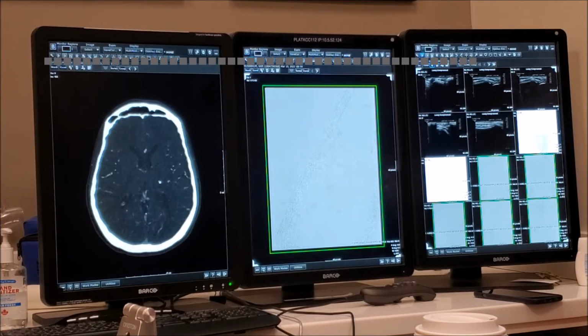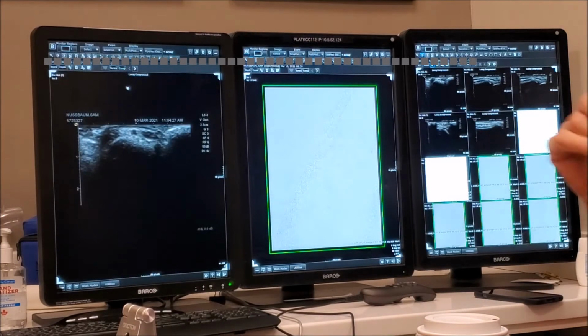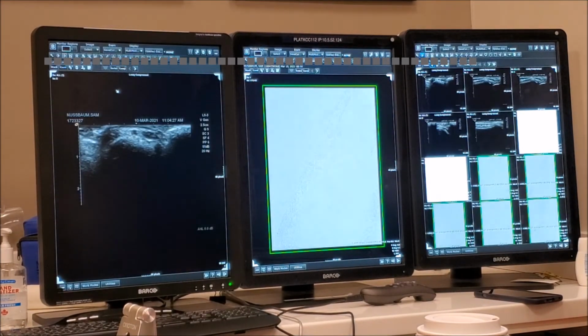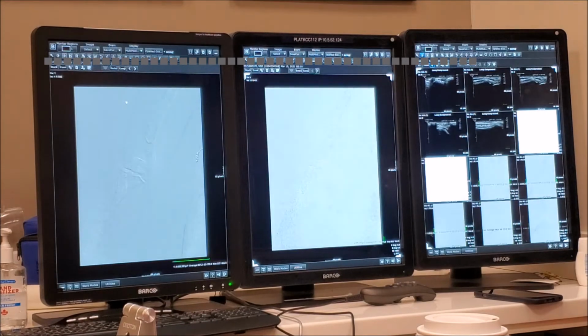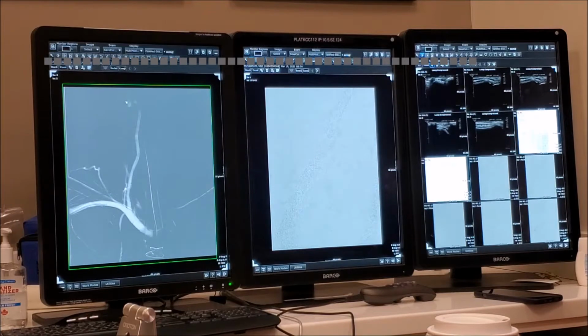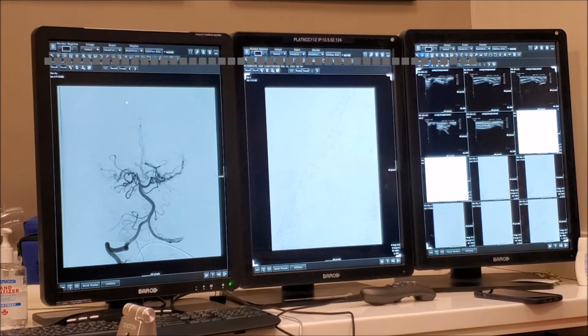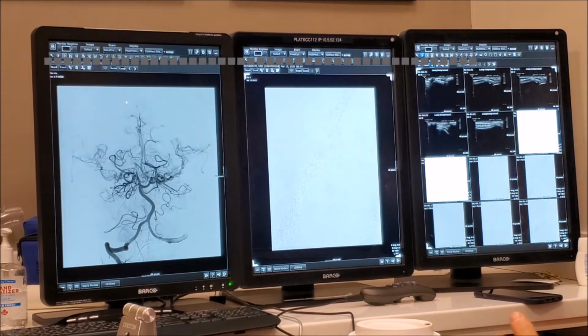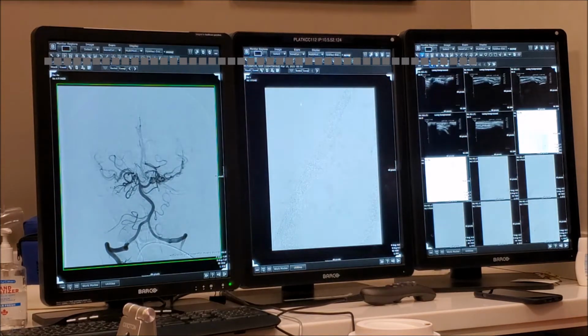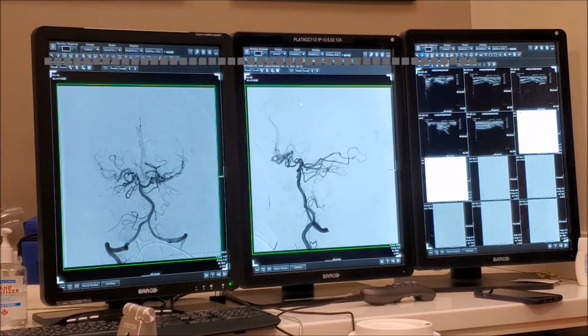Okay, so we've seen enough of this back and forth. Show me the angiography. It's okay to leave it there. So you're in radial. Try to select a right vertebral. So this is a right vertebral injection with reflux. Okay, so leave that there, put the lateral on the other screen. Okay.